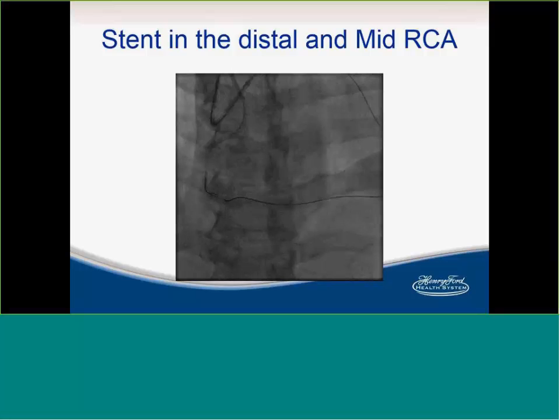So it's very important here to get your Corsair all the way to your distal cap retrogradely. Now we see, if you notice, the tip of the knuckle, the antegrade knuckle and the Corsair, they're dancing. They are in the same plane, in the same vessel, and so they are very close. All I need to do now is basically to puncture retrograde. However, there is a stent.